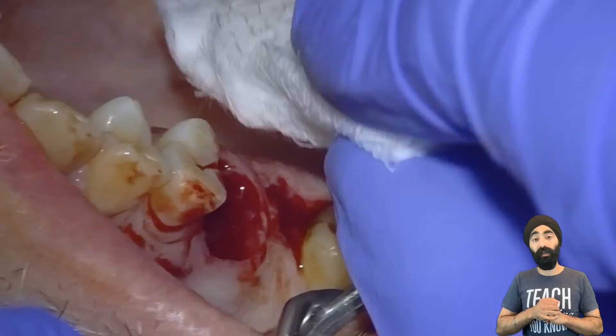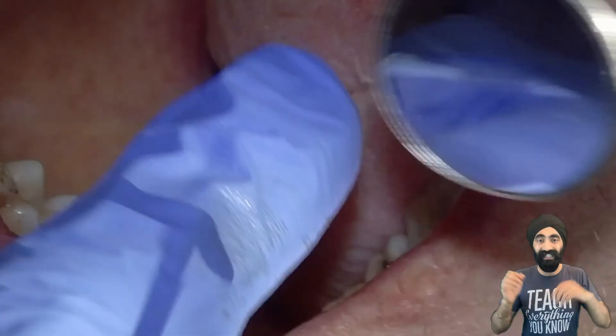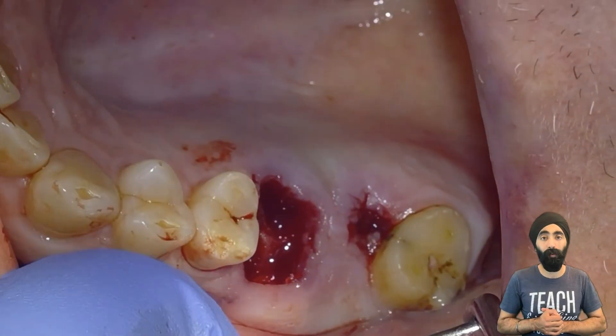I'm now curettaging, making sure that everything's nice and clean — no debris, no root dentine, no fractured tooth inside. And you can see how clean a job that is.